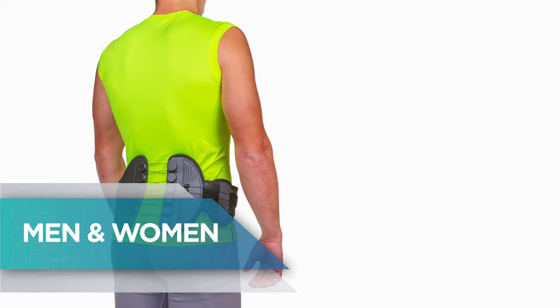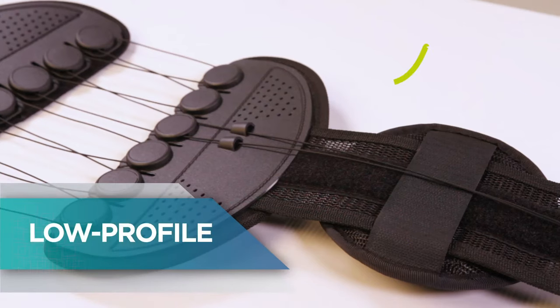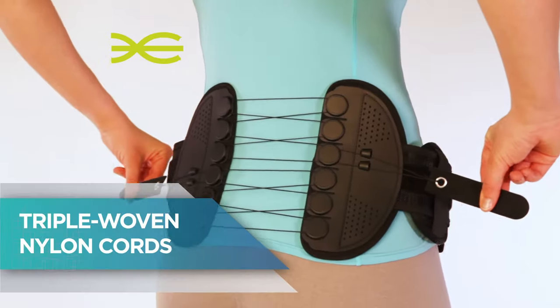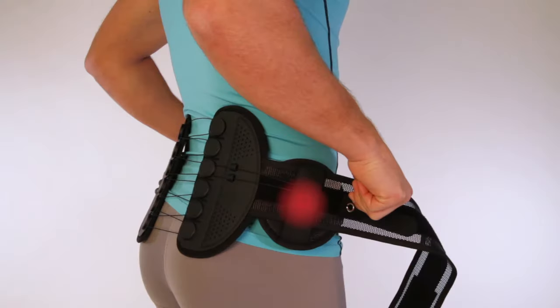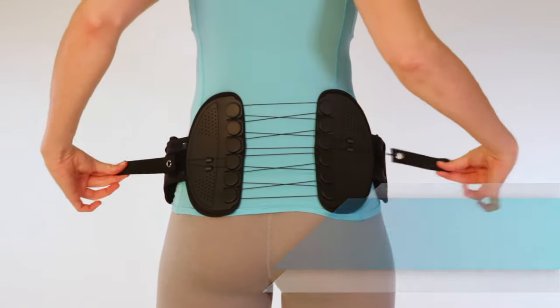Universal design fits most men and women. Breathable, low profile, and lightweight. Made of medical grade materials with triple woven nylon cords. Adjustable and removable pads apply targeted pressure to particular sore areas. The rigid posterior provides increased support and protection.